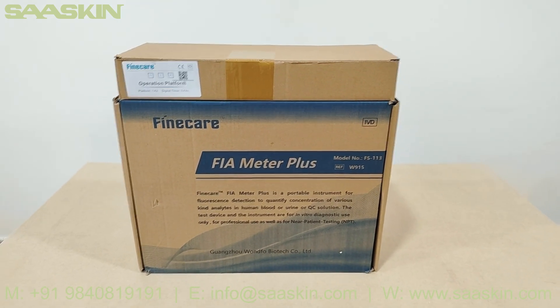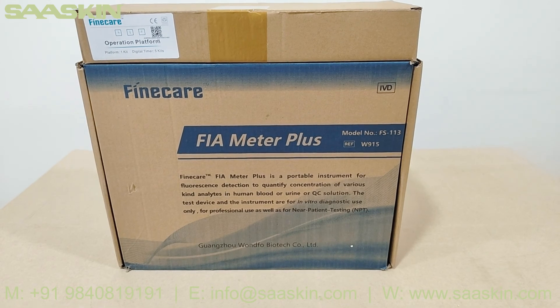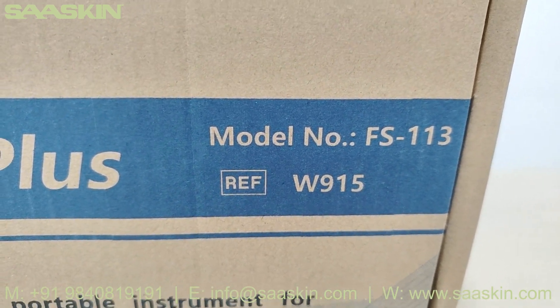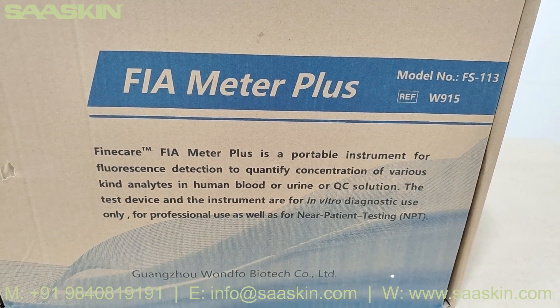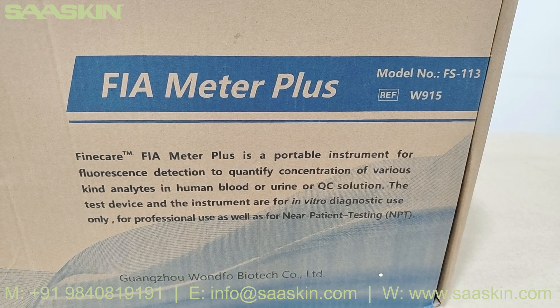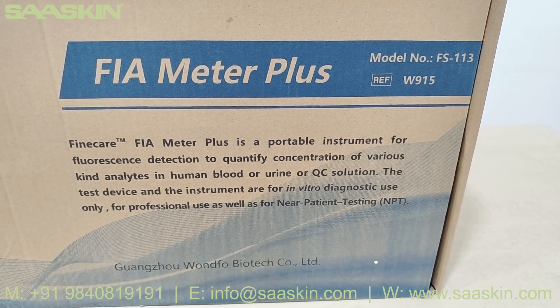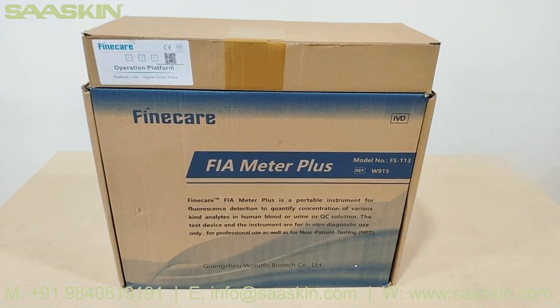Hello everybody, today we are going to see the unboxing of the Fine Care FIA Meter Plus. This is the top and front view of the analyzer. The model number is FS113, reference number W915. The Fine Care FIA Meter Plus is a portable instrument for fluorescent detection to quantitatively measure concentrations of various analytes in human blood, urine, or QC solutions. The device is for in-vitro diagnostic use, for professional use, and for near-patient testing.